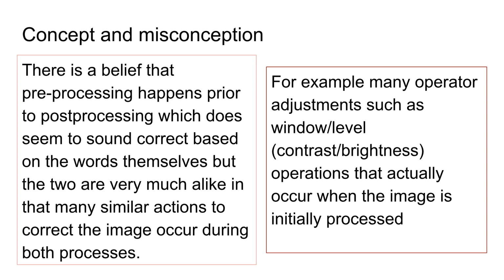Things that you may like to do, a lot of techs do this. I don't know why. I understand images might not look as bright as they want them to be, or they don't like the contrast, but we shouldn't really manipulate those things because the monitors that we look at are not necessarily, and most likely not, the same as the expensive monitors that the radiologists look at.